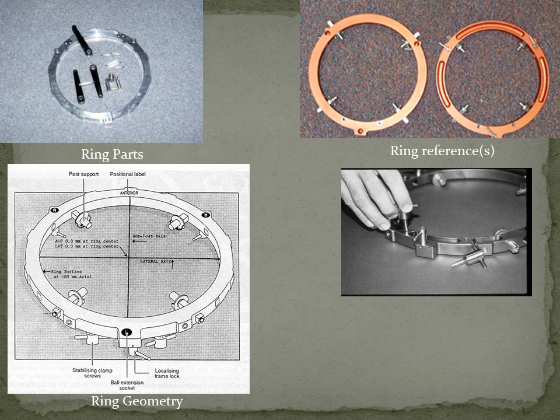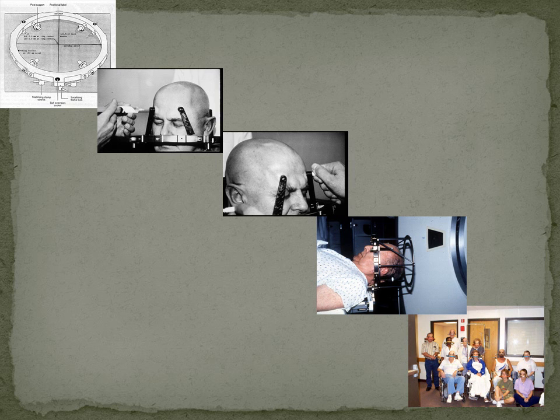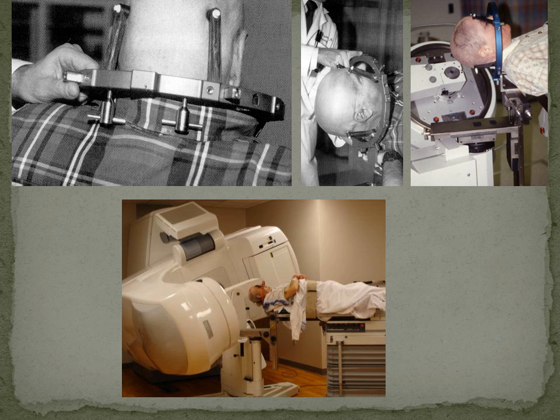And once you get that pressure on the patient and you get the head ring tightened down, they lock in place. And then you have to pay attention as to whether you're adding some sort of fiducial system like we did in CT or angiography, or whether you're actually mounting the ring. All those coordinate systems have to match. And again, tomorrow we'll talk about the ring process. But the important thing is that everything from here all the way through imaging, all the way through treatment is known, and all is relative to the ring reference.